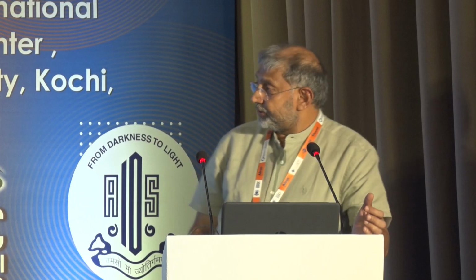So sometimes, even if the cornea is clear, you have internal higher order aberration. Those are the patients which are in contraindication for doing a corneal based refractive surgery or even doing an ICL, because their vision will not be good enough.